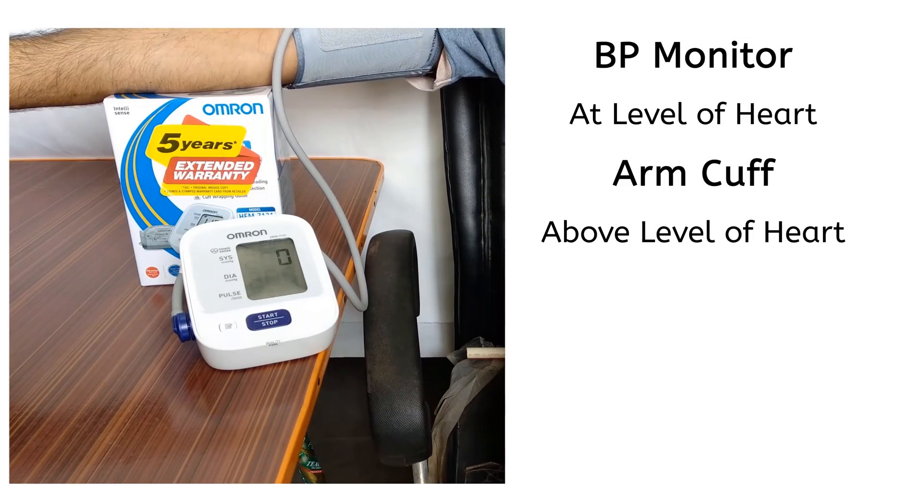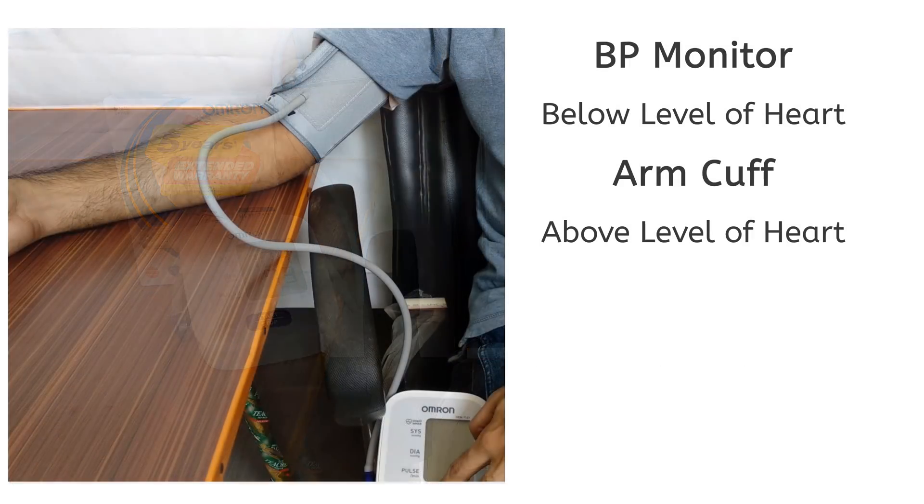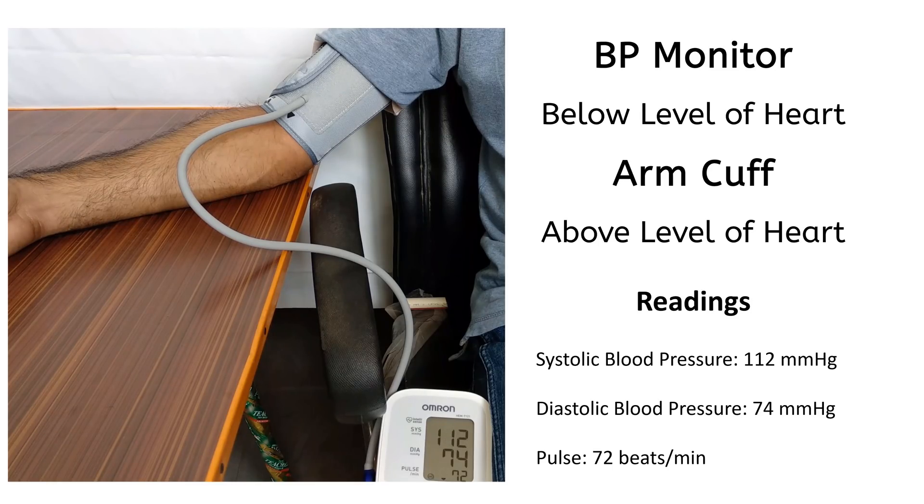This position is with BP monitor below the level of heart and the arm cuff above the level of heart. These are the readings on the monitor.